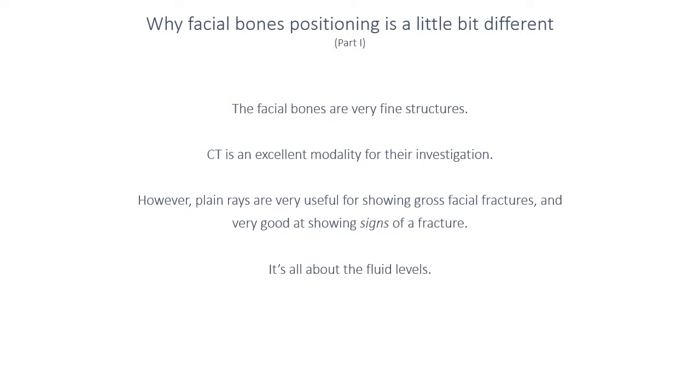One of the advantages of plain rays, however, apart from the fact that it can have a very, very much lower dose than a CT scan, is the fact that plain radiography can show signs of a fracture. And the most notable of these is fluid levels within and around the maxillary sinuses.